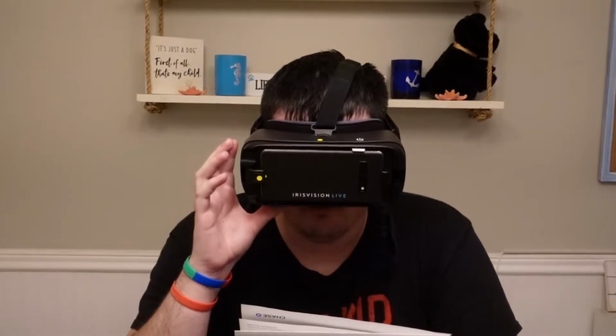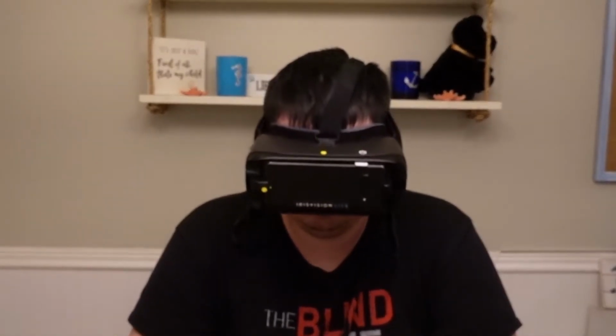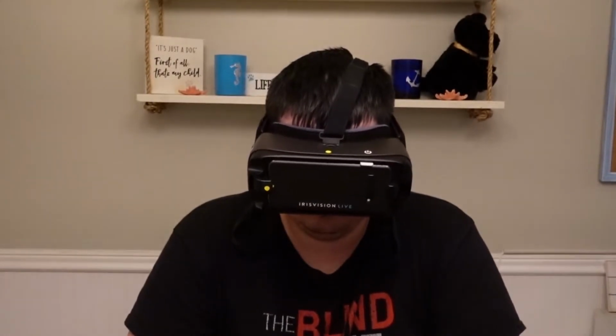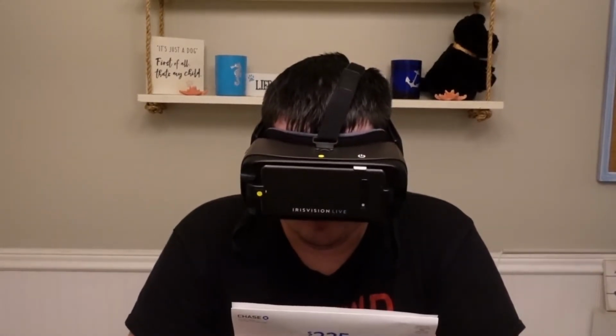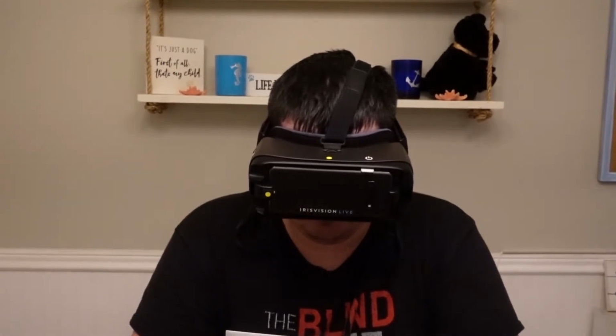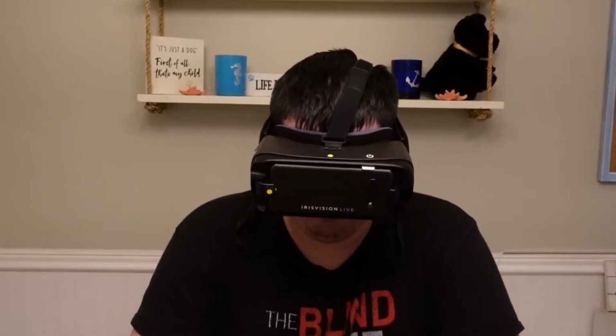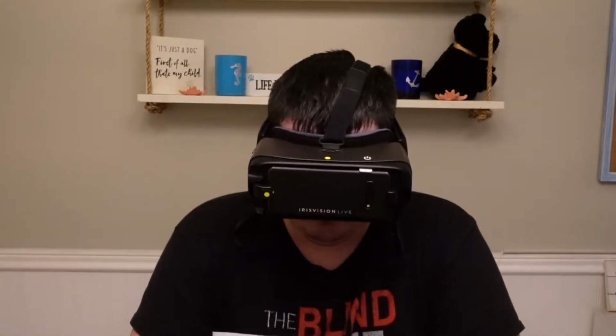Reading green. Reading green is a variation of the reading mode itself, which shows black text on a green background. Pretty self-explanatory there. I actually really like this one, to be honest. I kind of like the contrast of the black on the green. I can actually see myself using this one a lot if I have my own IrisVision Live. I really like it.